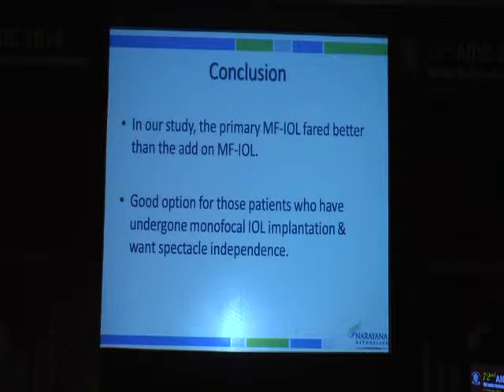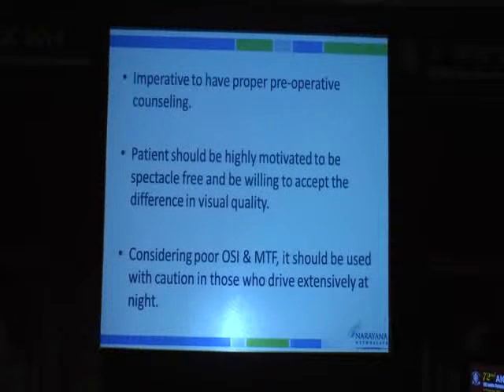So in conclusion, in our study, we found that the primary multifocal IOL fared better than the add-on multifocal IOL. This might be a good option for patients who have already undergone monofocal IOL implantation and want spectacle independence. However, it's very important to have proper pre-operative counseling, and the patient should be able to accept the fact that his vision might not be as good as an eye with a primary multifocal IOL.